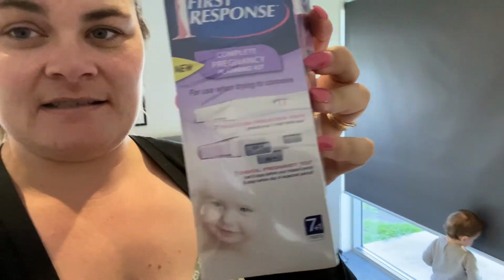So when I'm close to peak ovulation or I'm surging, so my fertility's high, I will use a normal ovulation strip. They're very cheap. A digital First Response, so they look like these. I will show you guys once I've peed on it. I won't show you beforehand, but I use one of those.